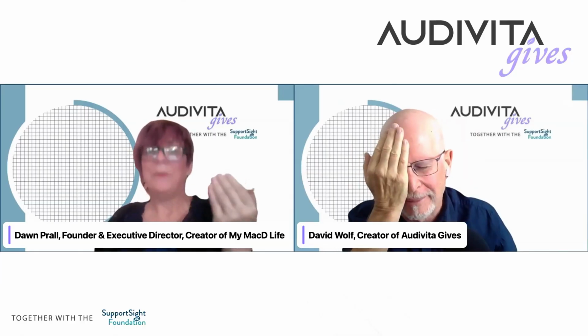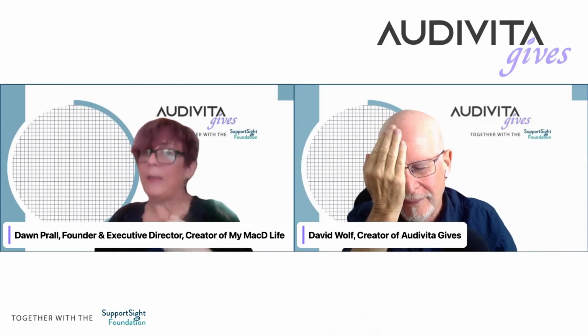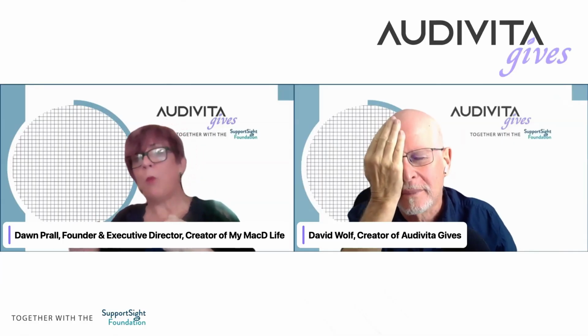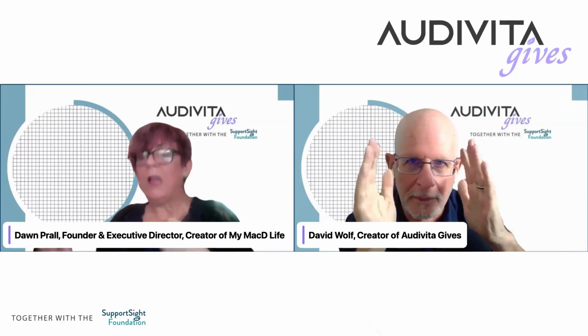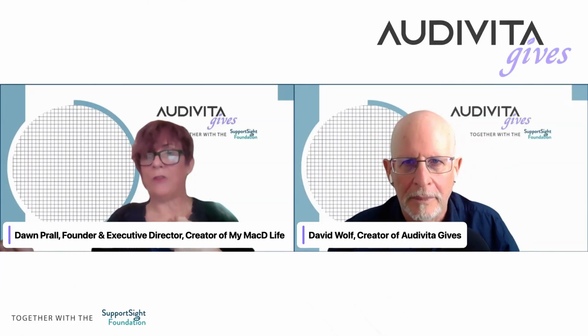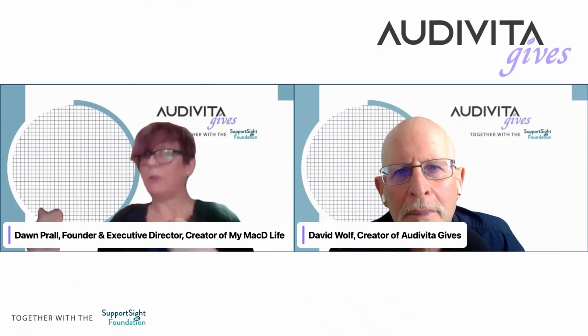Sometimes people have to do it more than once, because you want to make sure, especially if you have the disease, that your brain is registering it the same. So if you're seeing wavy lines, if those straight lines are moving, if they're jumping off the page, or if they're blurrier, you might want to double check it a couple times in a row with that same eye.